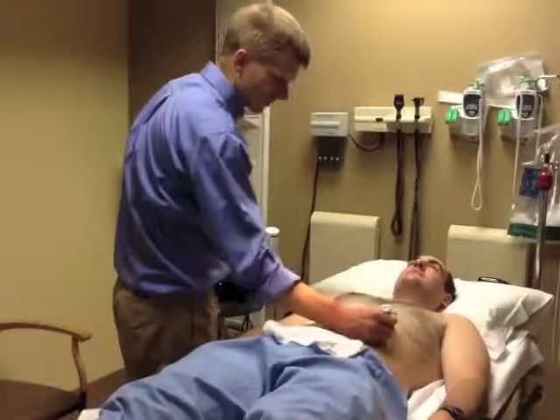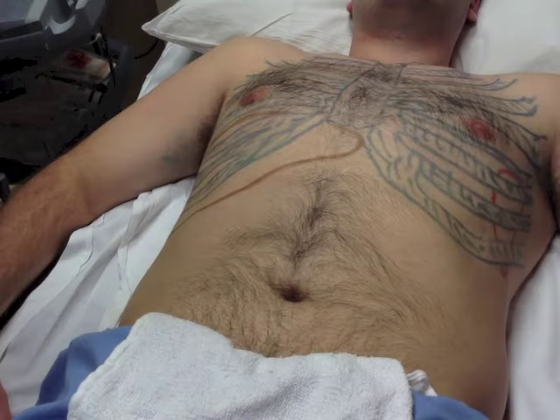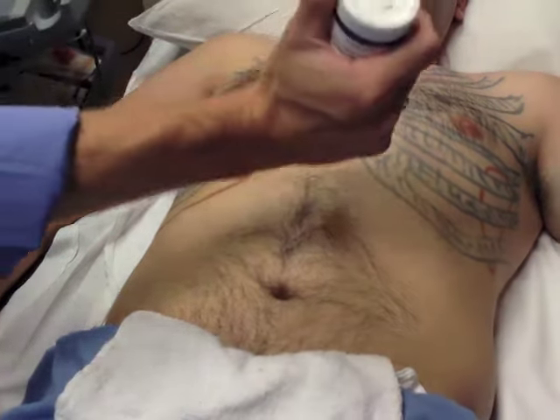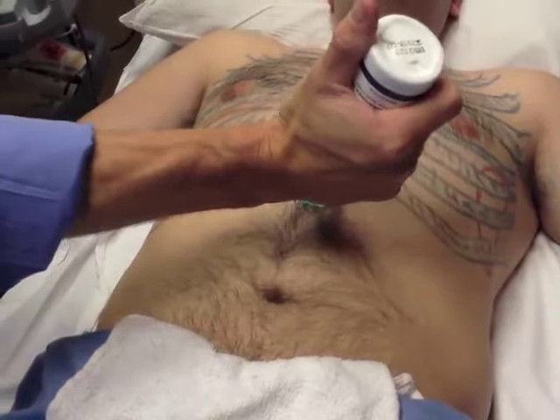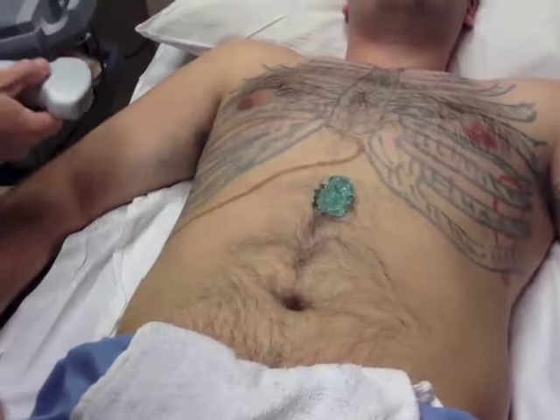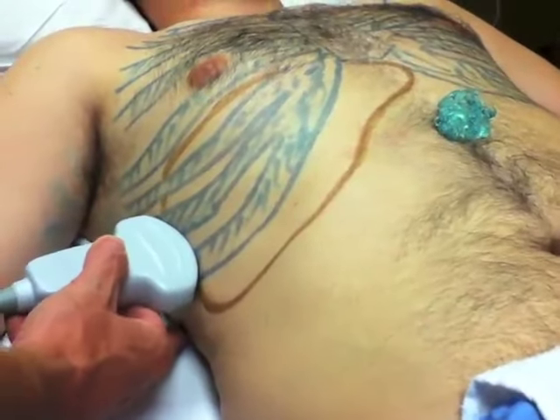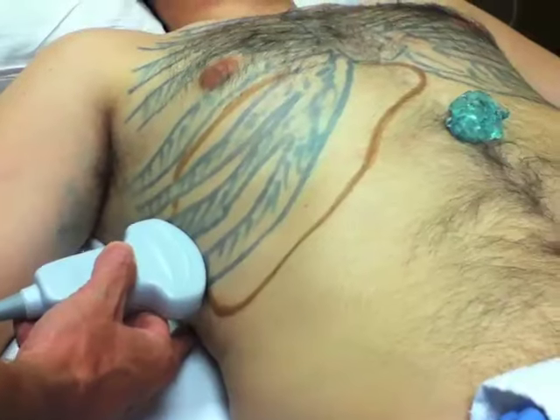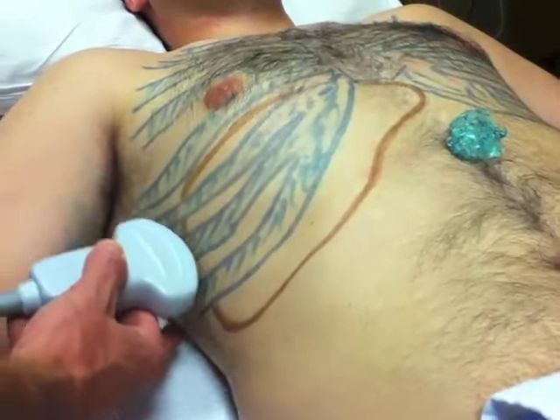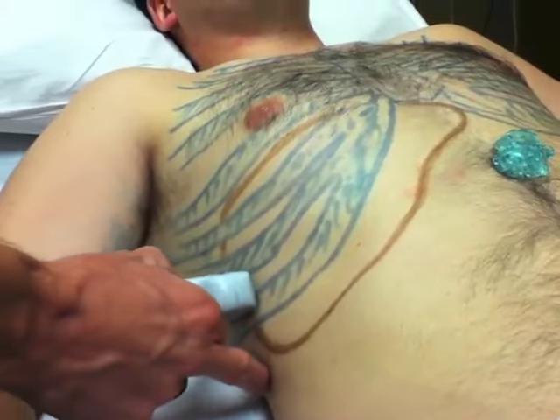Alright, take off your shirt. Perfect. I've drawn some anatomically accurate thoracic anatomy on Felix Hegarty's chest to help illustrate important structures and relationships. To start, put a glob of gel on the epigastrum — this saves time. Start in the right upper quadrant with the probe horizontal, mid-axillary line near the lower ribs. If you don't see anything, move the probe more cephalad or caudad until you see liver. Once you see liver, you can oblique the probe to maximize your window in between the ribs.